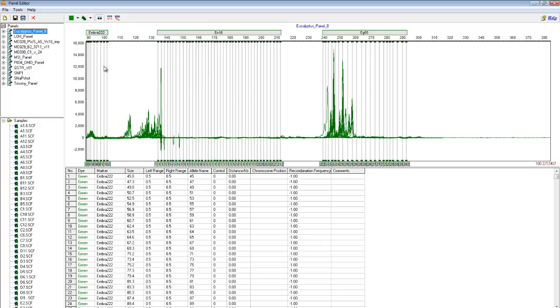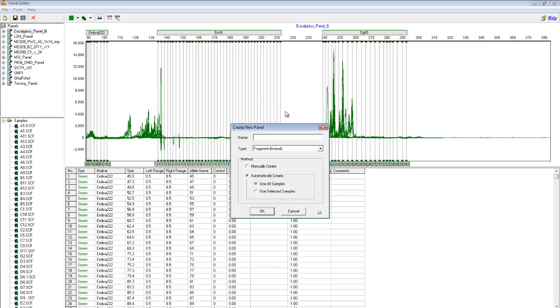To make a new panel, just go to File, Create New Panel. Enter a name, in this case I'll choose New Panel as my name. Choose the Data Type, and then choose the Creation Method. We can see that there are two main methods here, Manual and Automatic. First I'm going to show you Manual.